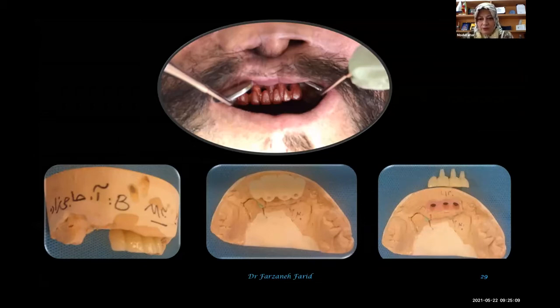At that moment, I considered what the problem was. As you see, the direction of the connection that goes inside the implant and the direction of the crowns are 90 degrees. They are perpendicular to each other. I had never seen anything like this, and I have not seen it since. And when I asked my colleagues, they said that they have not seen something like this either. And we just can't have this kind of treatment for this patient.